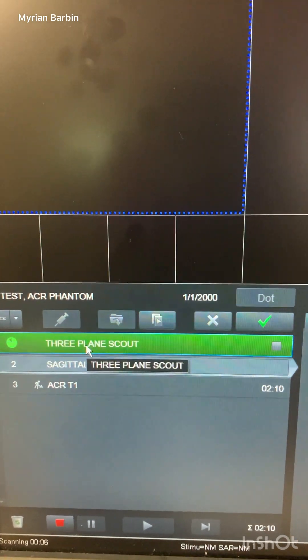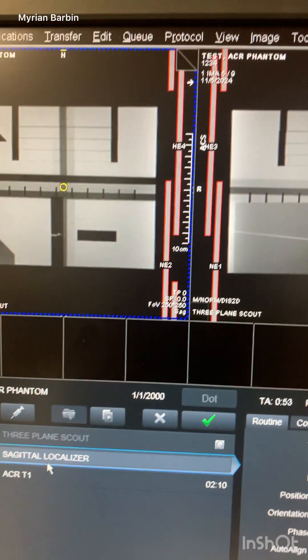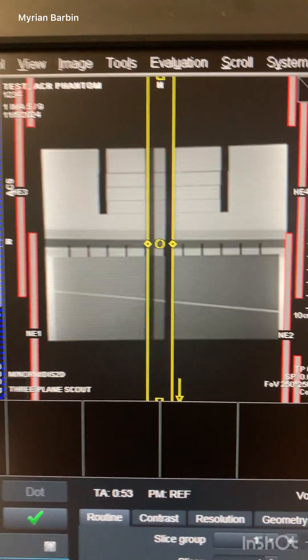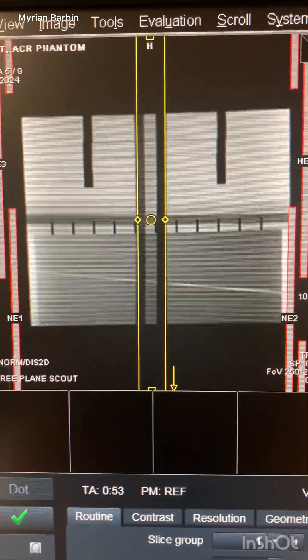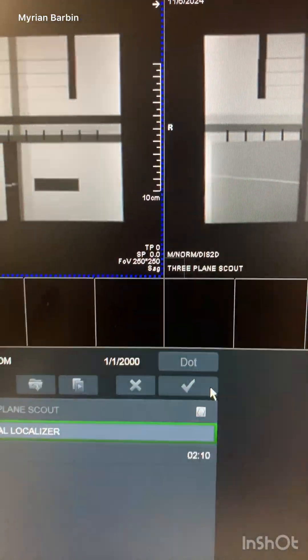After the three-plane scout is done running, the sagittal localizer will come up. This is how it looks — everything looks nice and centered, so I'm not going to move anything. I'm just showing you how it looks centered, and then I hit go.